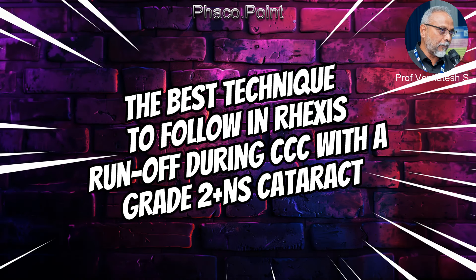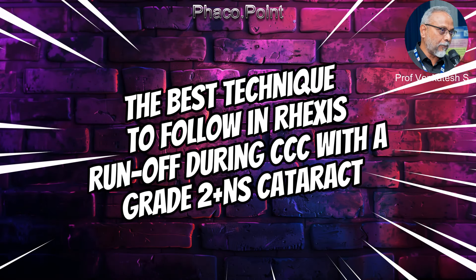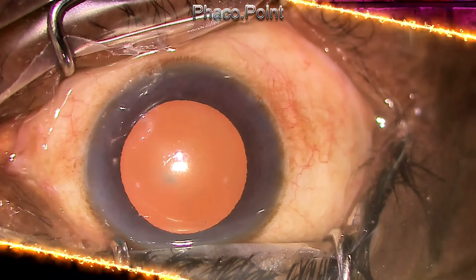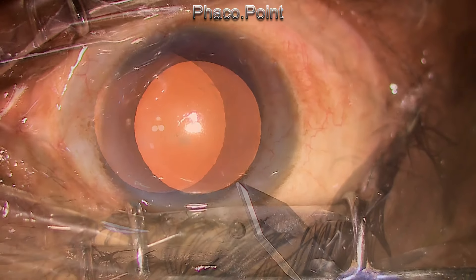Hello friends. I think this is, in my opinion, the best technique to follow when you have a rhexis extension while performing CCC in a reasonably hard grade 2 or grade 3 nucleus sclerotic cataract.